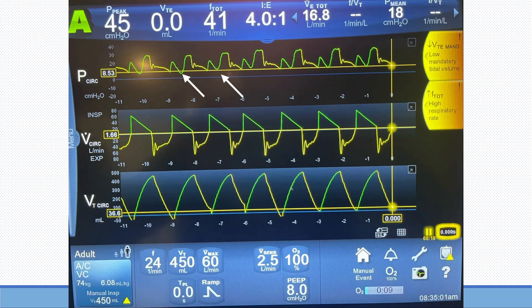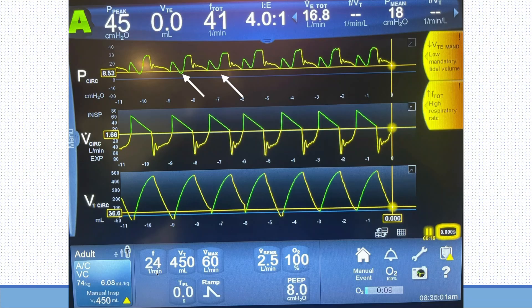I'm going to use this case to demonstrate the concept of respiratory drive measured by the P0.1, which is the drop in pressure in the first 100 milliseconds of inspiration. The patient is on assist control mode of ventilation, targeting a volume of 450 ml — volume control — with a maximum flow of 60 liters per minute that then decelerates. The patient is on 100% FiO2, PEEP of 8, and the set respiratory rate is 24 per minute.